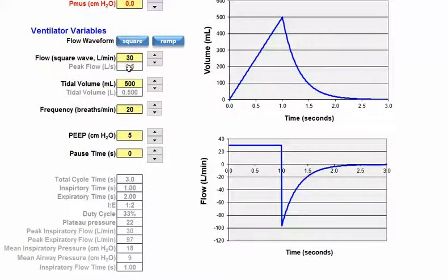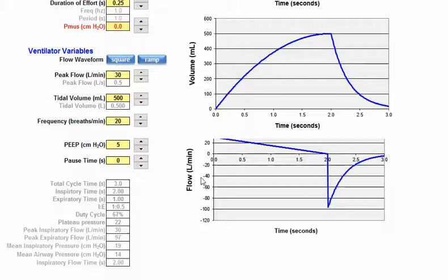So it was double of what it was with my square waveform. So I went back to my square waveform, my flow's at 30, inspiratory time is one second.